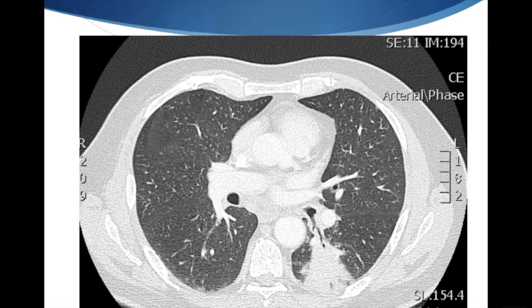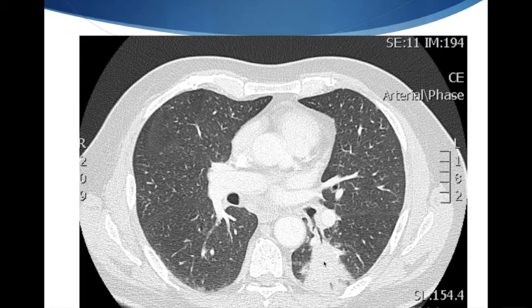So bronchoscopically, especially with radial EBUS, we could biopsy this by putting the bronchoscope into the left lower lobe airway, using the radial EBUS to confirm our position and biopsy this.